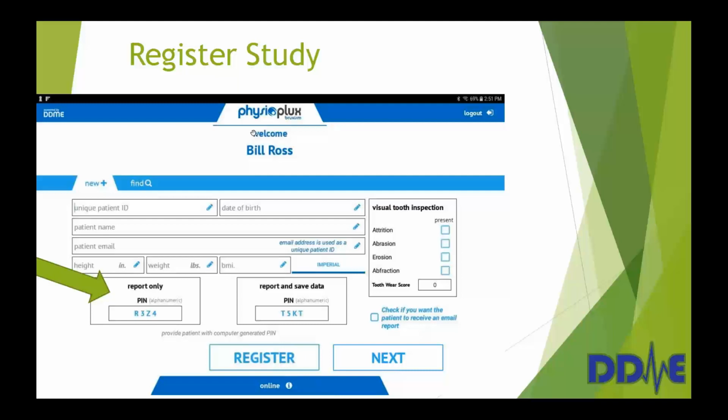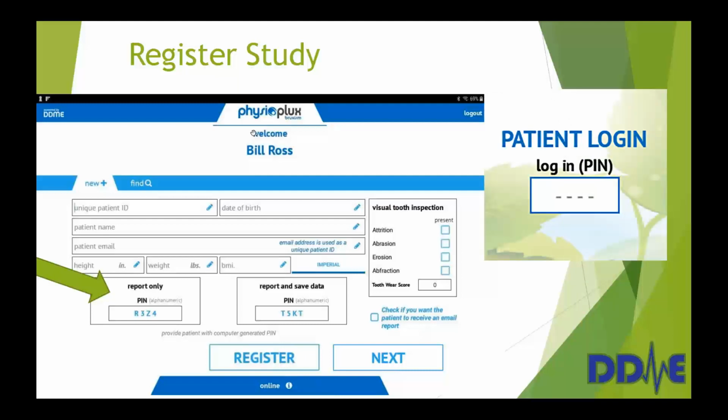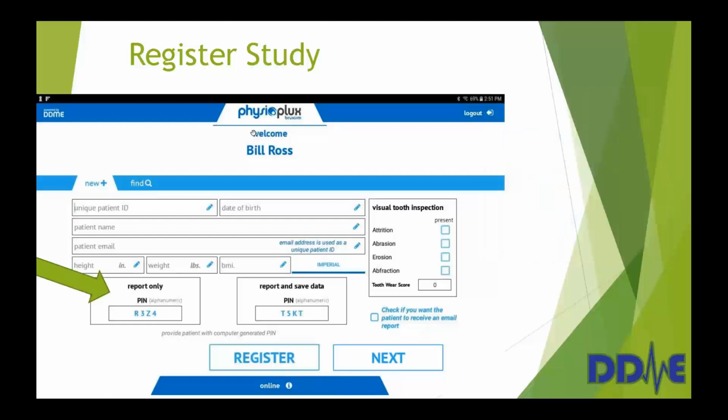The other thing that we recommend is that you maybe keep a log and say patient, whatever the patient's name is, and then put this PIN that you've assigned to that patient on that log. The reason being is that if the patient does not connect to Wi-Fi at home, and they don't have to, when you receive the GEMPro back from that patient, you just type in that PIN and the tablet will automatically send you the report through email. Okay, so that's why we recommend keeping that. Once you've completed documenting the PIN, both for your patient and for your own records, click register and next. And you'll be going to the second page of the form.